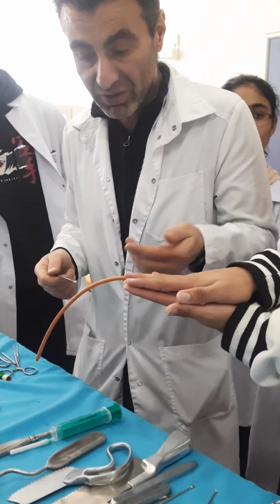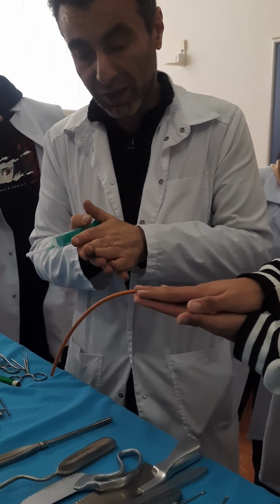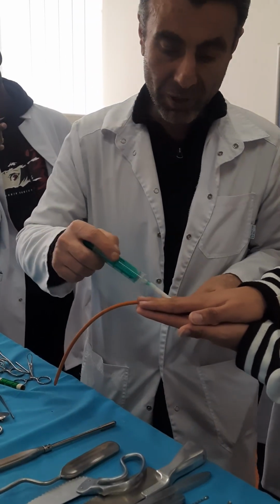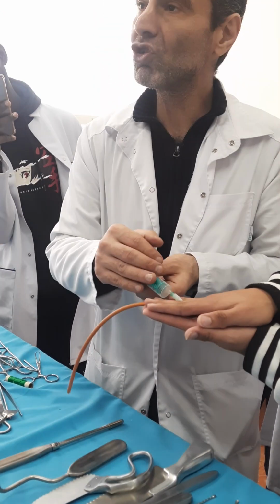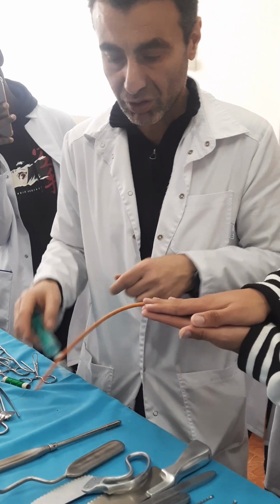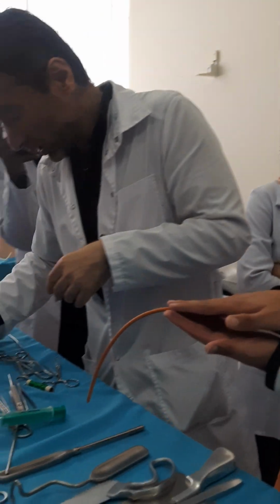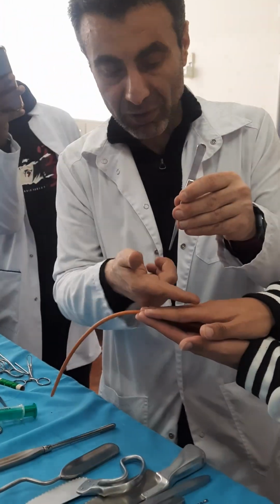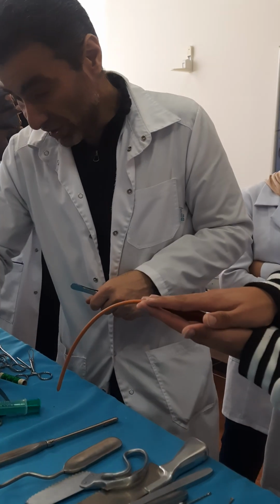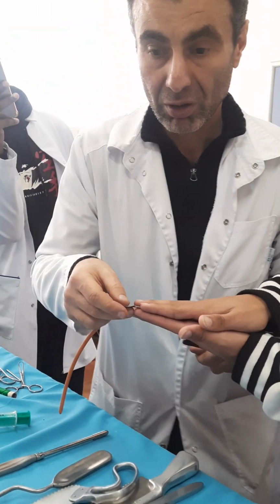Now what will be my sequence of work? For example, I need to cut them. They firmly touch each other. First, I will make hydraulic preparation. I will take Novocaine or lidocaine and inject it inside the loose connective tissue. Due to the volume of the liquid, the layers will be separated. Then I will take the dissecting forceps and lift the upper layer. With the scalpel, I will perforate it and insert the groove probe between the layers. Hold it.